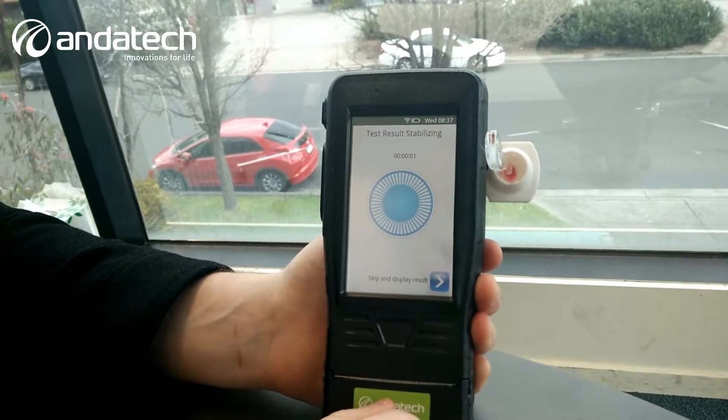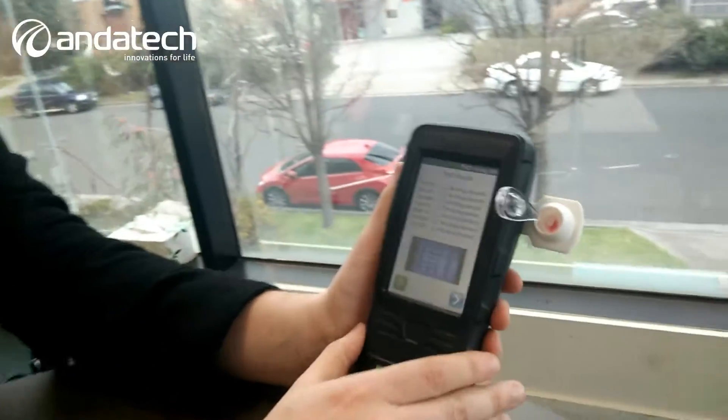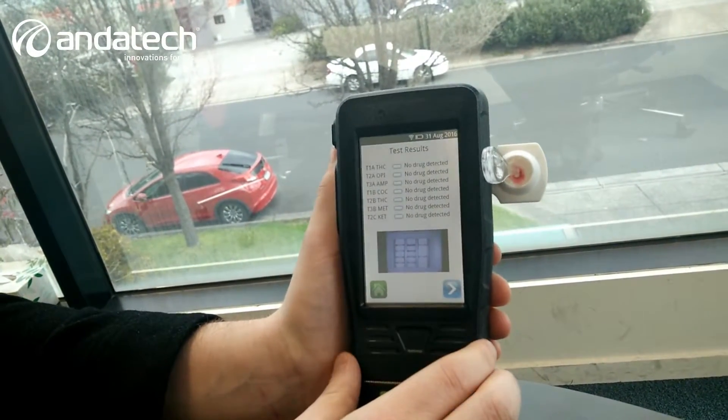As you can see, the test is coming to an end right now. All we have to do is confirm the results — that'll take about one minute. This unit retails at $3,999. The test actually completed a lot faster. For the first ten customers for this unit, we'll be offering them 25% off. It has detected no drugs on the cassette, so I'm clean to be working and doing this video.